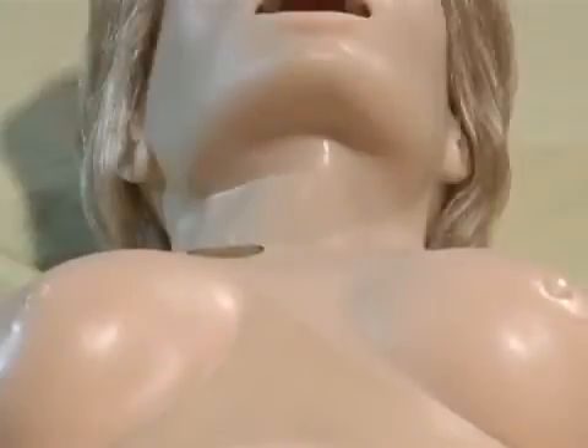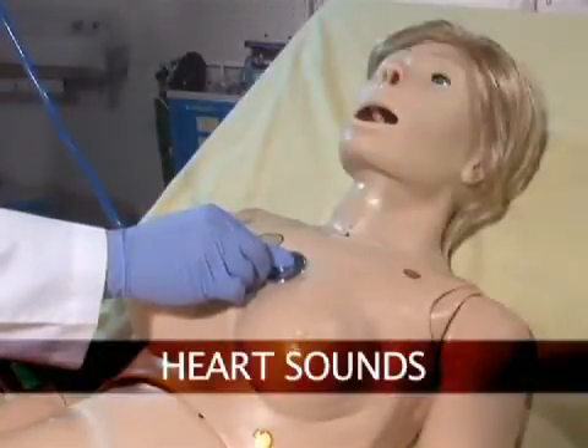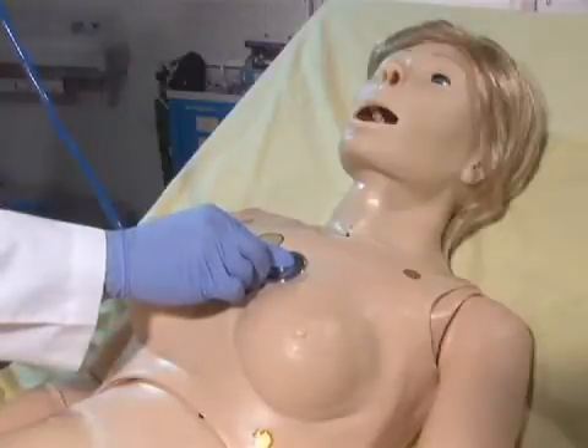Either lung can be disabled at any time to simulate a collapsed lung. Susie is equipped with several realistic heart sounds which are tied to a user-defined heart rate and selectable rhythms.